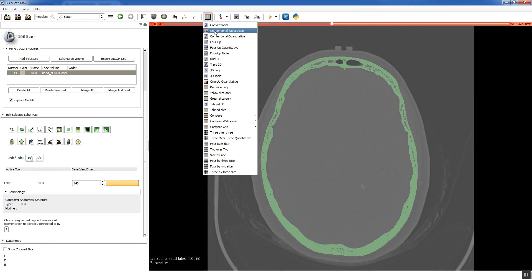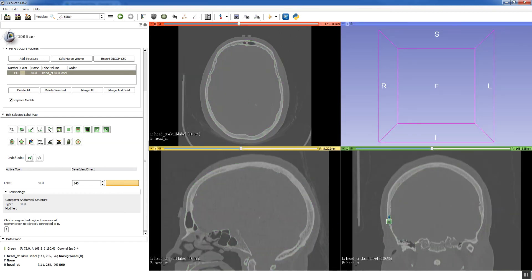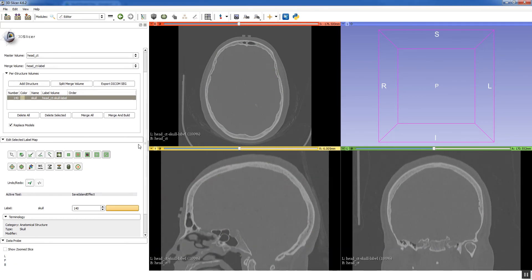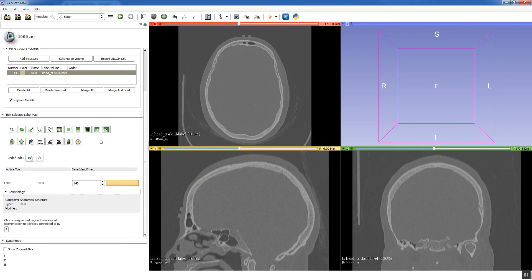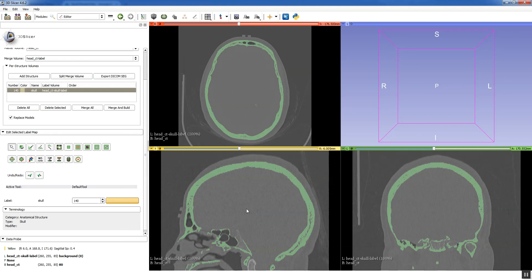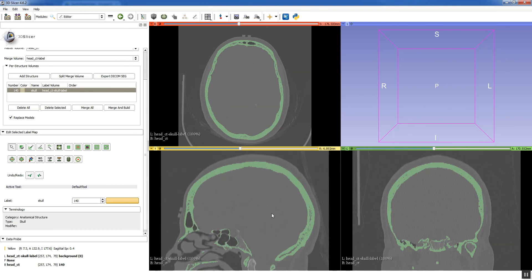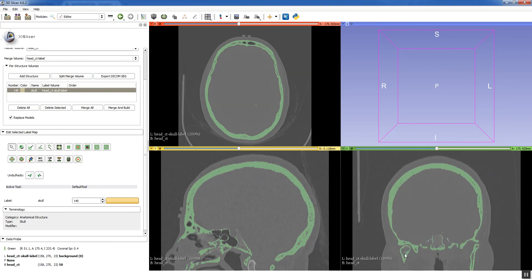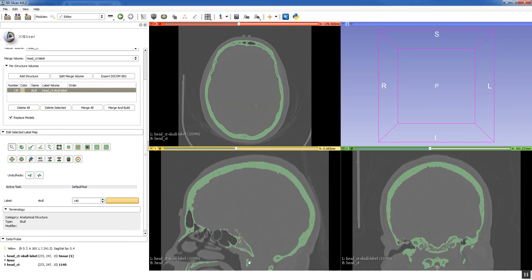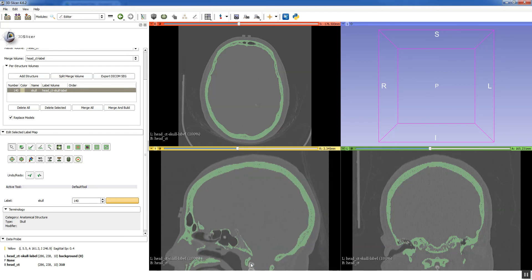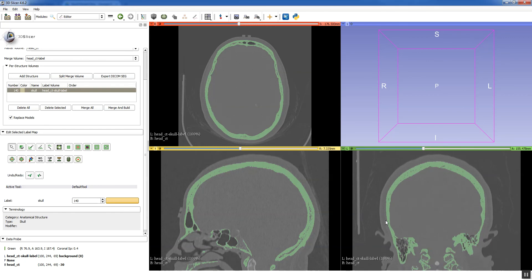So thresholding and identifying islands gets you 80% of the way pretty easily. But if we switch back to the 4up view, and kind of look at our... Oops. I actually clicked Save Island. So there is an Undo function. It's good to know about. I'm just going to go to the Select Default tool. That way I'm not going to screw up anything. So here we are with our skull segmented. But you can see there's still some things that we may not want in our model. Like we may not want the mandible included. We may not want the styloid processes. C1 is still part of it. C2 got excluded.